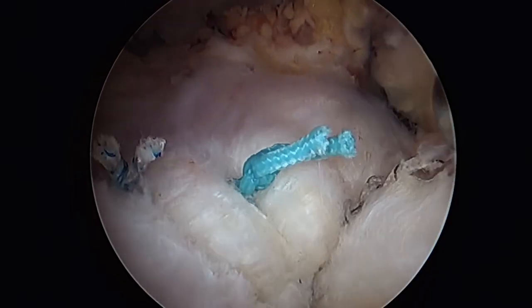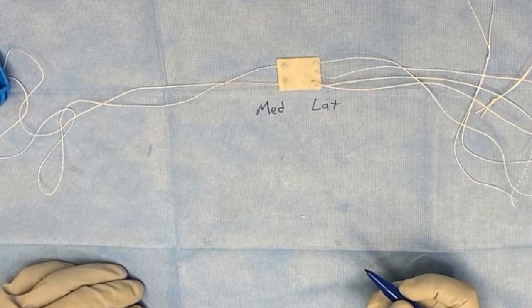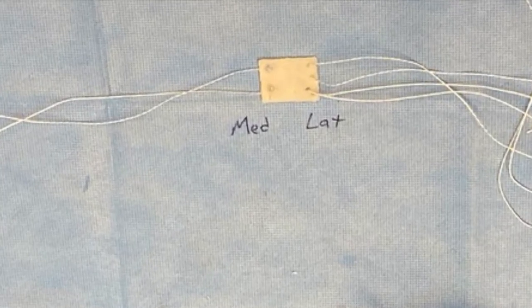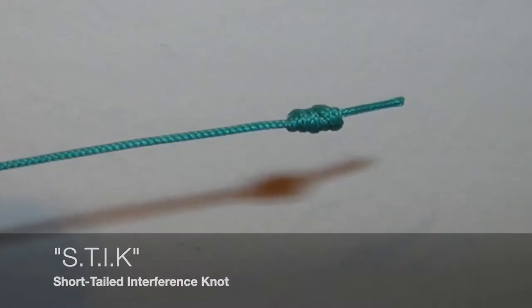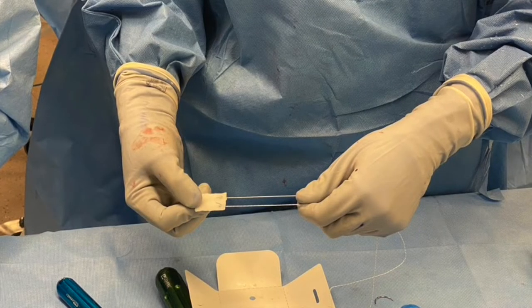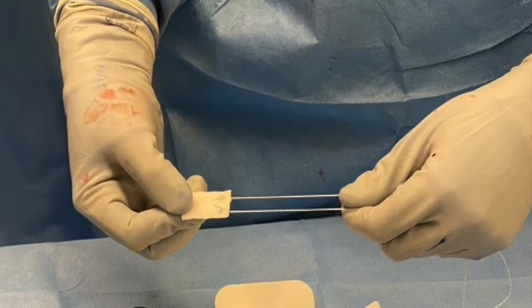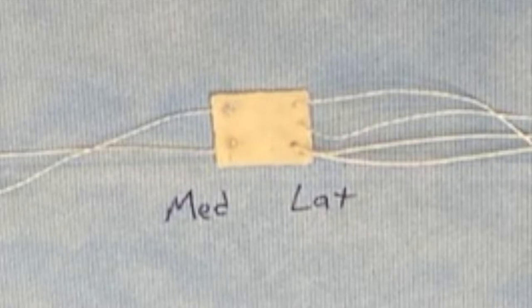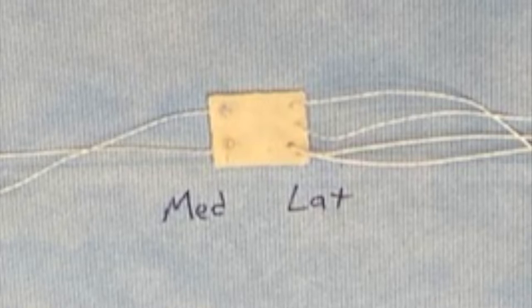After this we'll perform the augmentation. The BioBrace graft is then prepared on the back table with two sutures medially and two sutures laterally. The two medial sutures are what we call stick knots or short-tailed interference knots. Like a mulberry knot, the stick knot prevents the suture from pulling through the graft as it's pulled into the shoulder. The two lateral sutures are placed in mattress technique with the limbs coming up and over the graft so it can be compressed down to bone later.